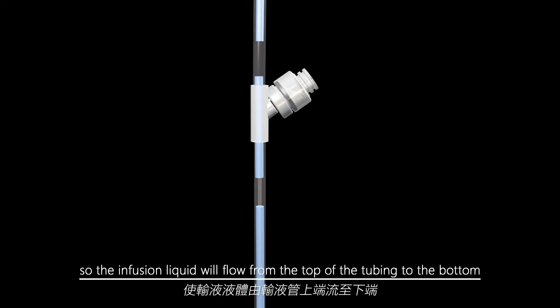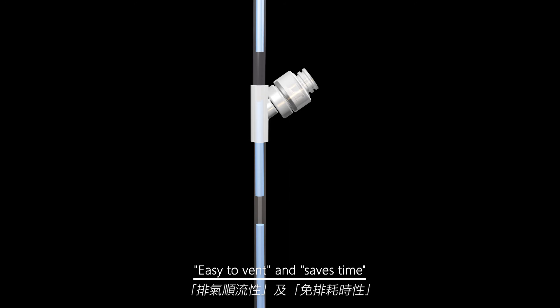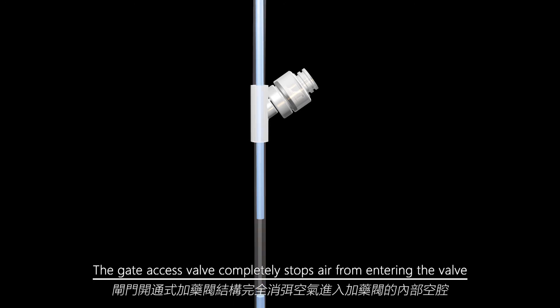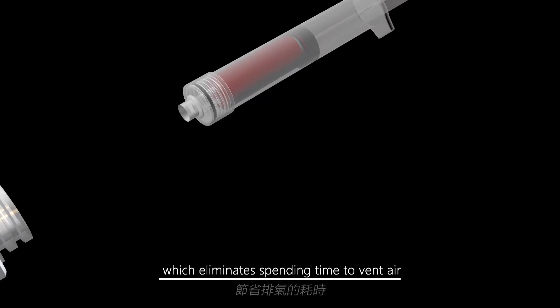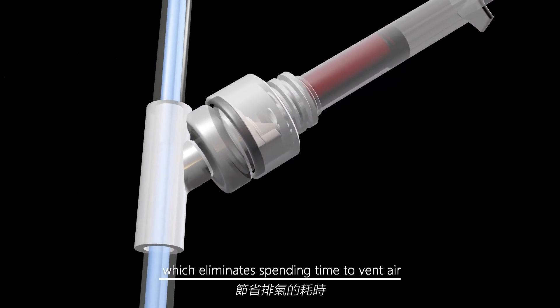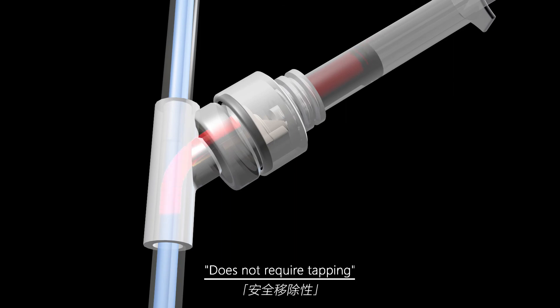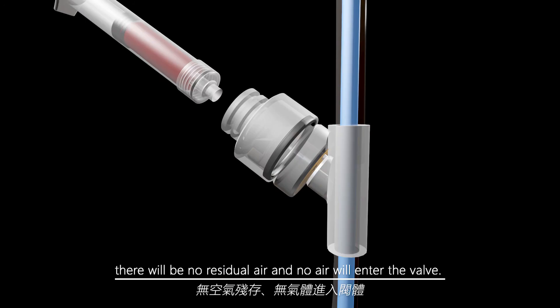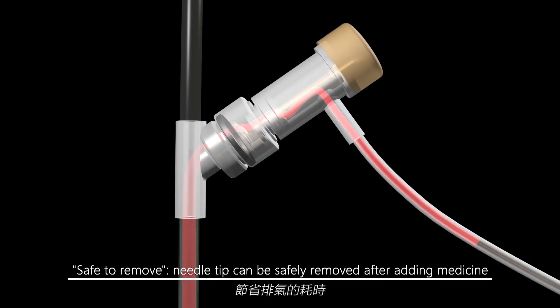Open the flow controller and vent the air in the tubing. The gate access valve completely stops air from entering the valve, which eliminates spending time to vent air. Does not require tapping — insert the needle of a syringe into the access valve; there will be no residual air and no air will enter the valve.